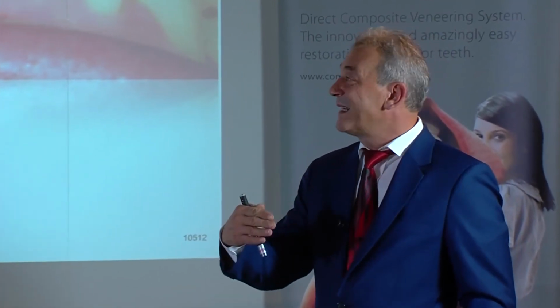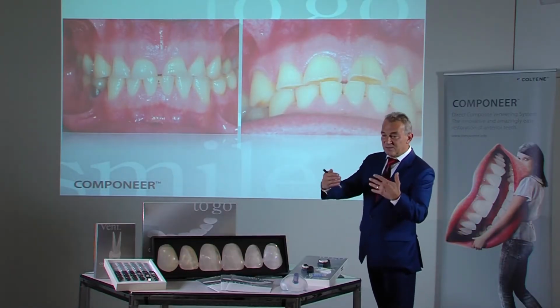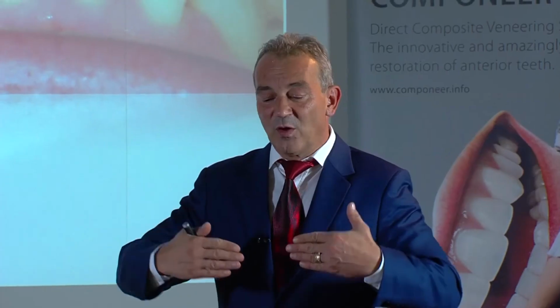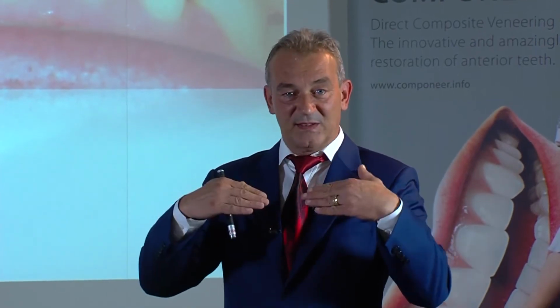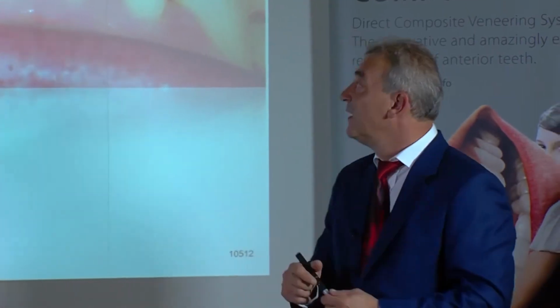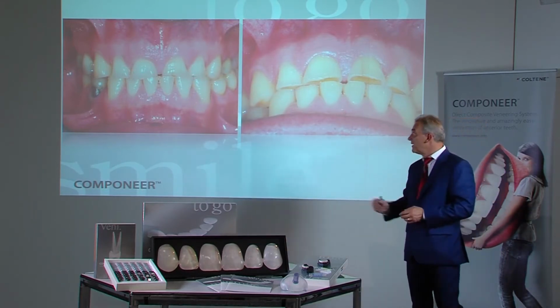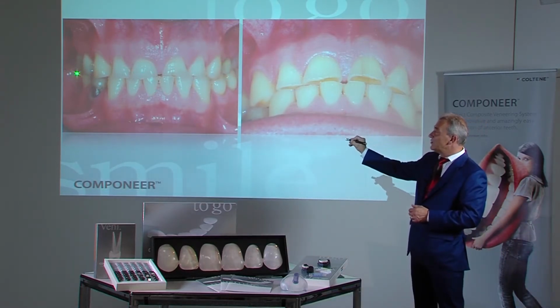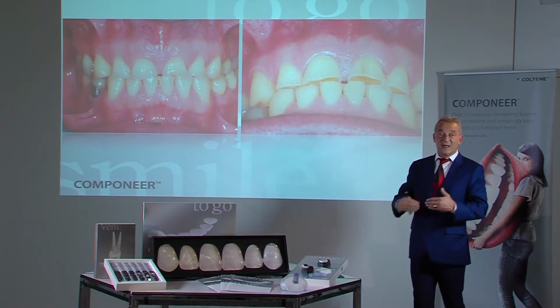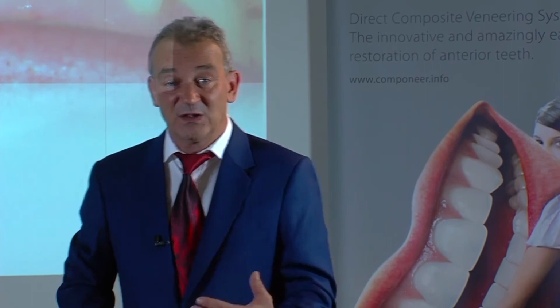This abraded the incisal edge bit by bit, resulting in relative elongation. Each fraction of the incisor that was abraded was followed by further pushing of the tooth. This meant that the tooth became shorter, while at the same time continuing to push up. This results in full contact during the end-to-end bite with an unvarying vertical dimension in the posterior region. If one restructured these teeth in the normal way, there would be no room. Bite elevation would be wrong in this case.